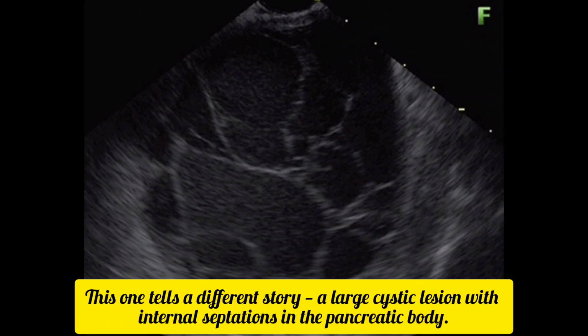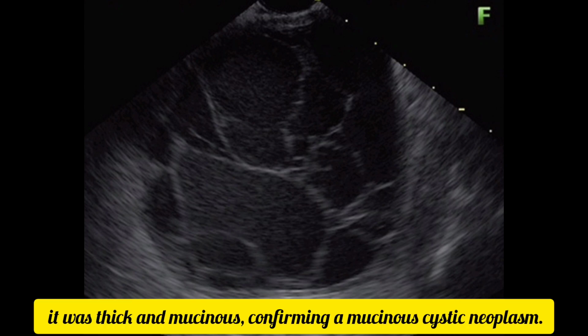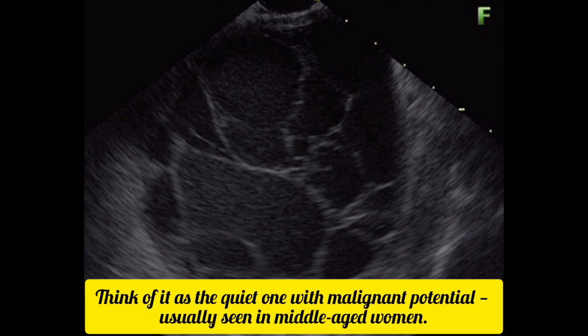This one tells a different story. A large cystic lesion with internal septations in the pancreatic body. When we aspirated the cyst fluid, it was thick and mucinous, confirming a mucinous cystic neoplasm. Think of it as the quiet one with malignant potential, usually seen in middle-aged women.